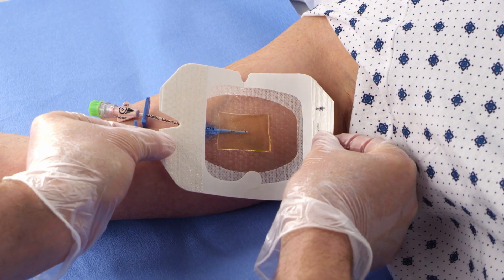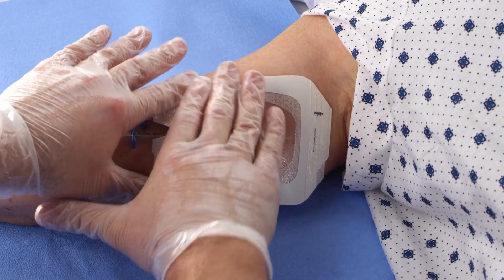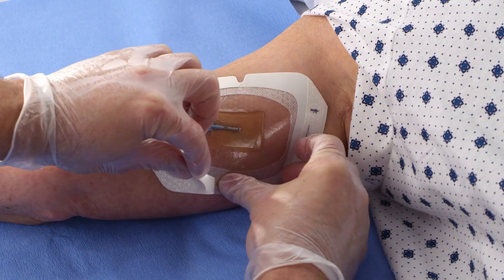Center the CHG gel pad over the catheter insertion site and smooth down the dressing edge. Do not stretch the dressing at application to the skin. Simply drape the dressing onto the site to avoid unnecessary force on the skin.